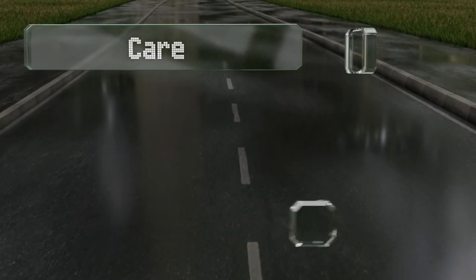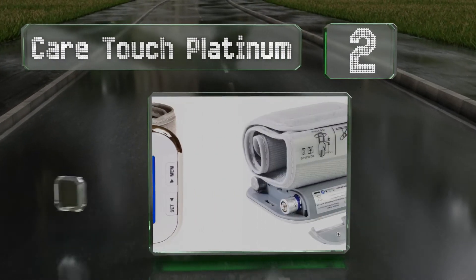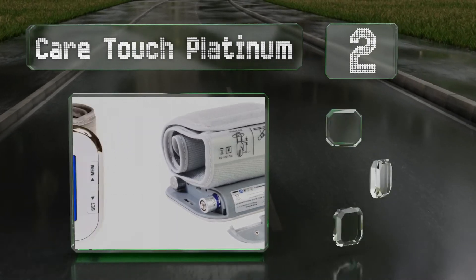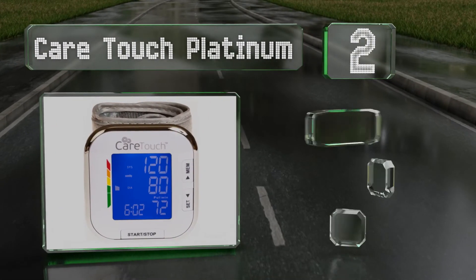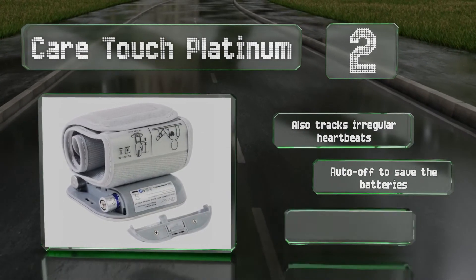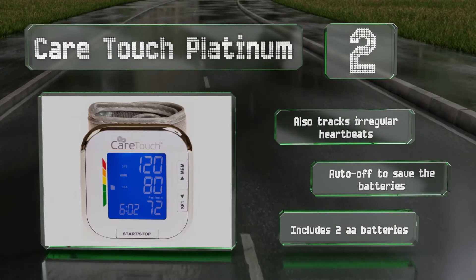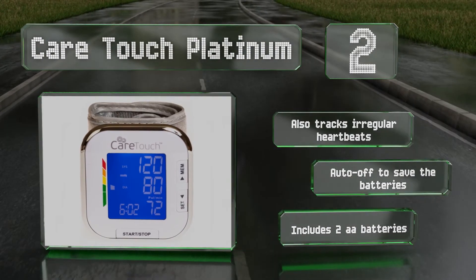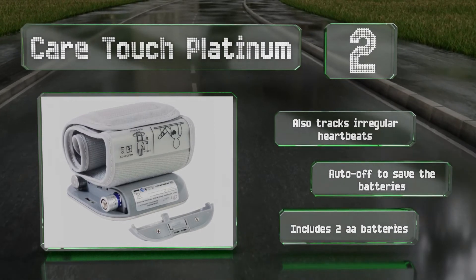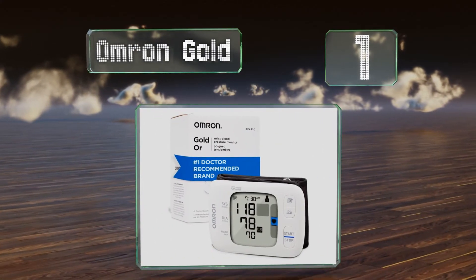At number two, the Care Touch Platinum boasts a fast response time of less than one minute and an extra-large backlit LCD that's easy to read in dim conditions. Leveraging dates and time stamps, the integrated memory maintains a 60-day history. It also tracks irregular heartbeats and includes the required two double-A batteries, and is equipped with an auto-off to save those batteries too.